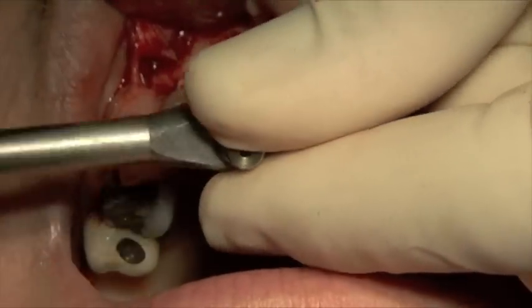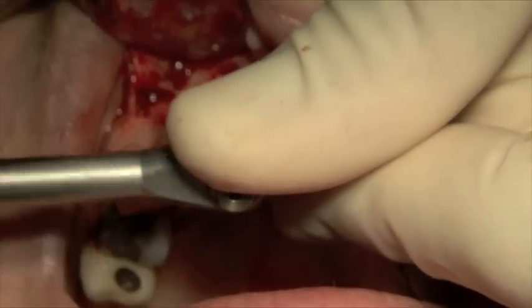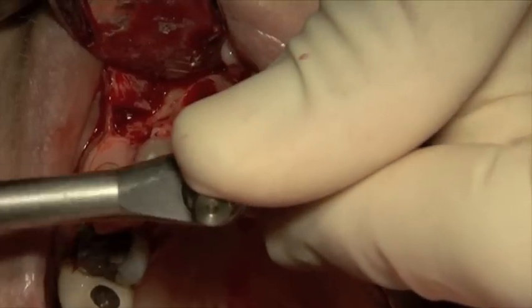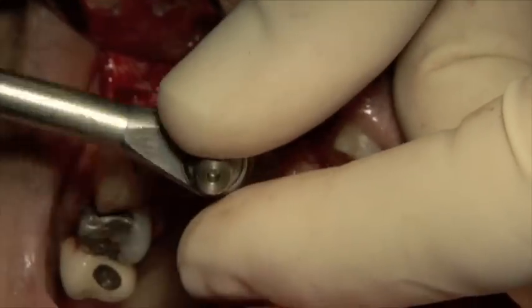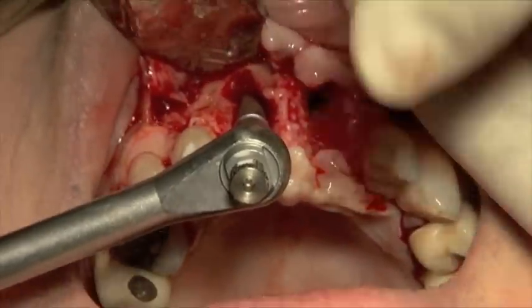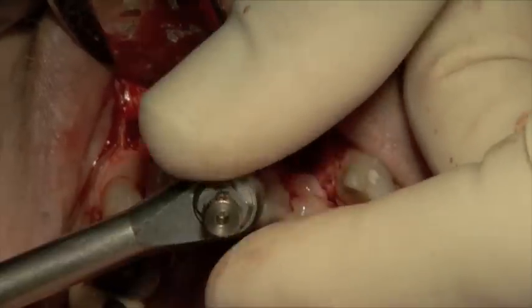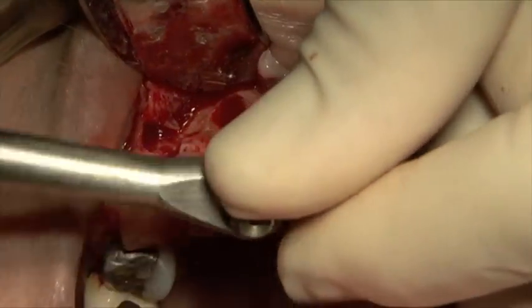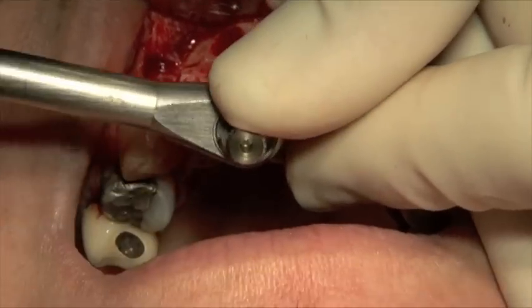More than 50. So because I've gone over 50, I'm now going to turn it out. What I've done is I've almost done the final preparation of the osteotomy site with my implant. I'm turning it back to take the pressure off the bone. If I don't, there's a chance of pressure necrosis of the bone. So what I've done now is I've got much, much better stability.